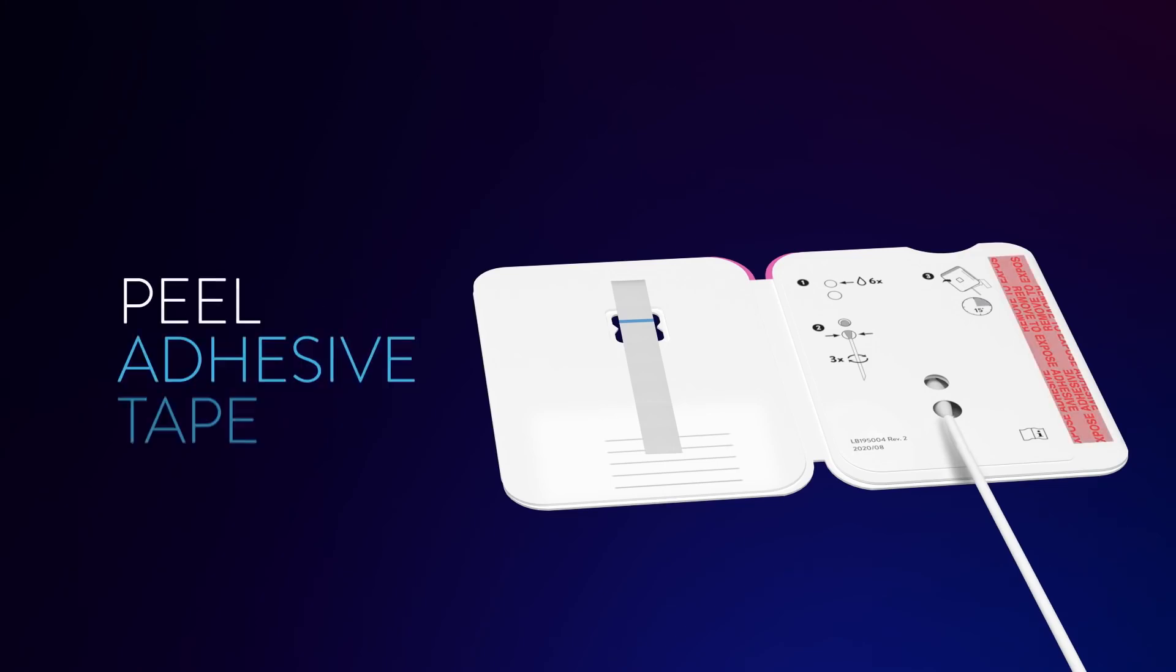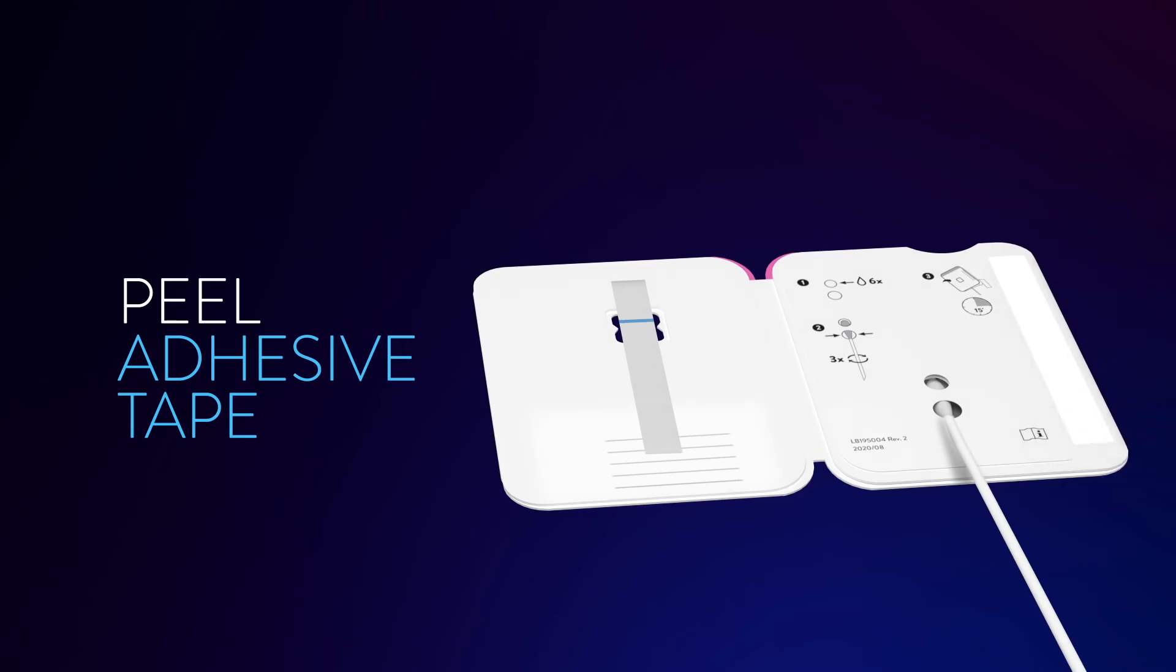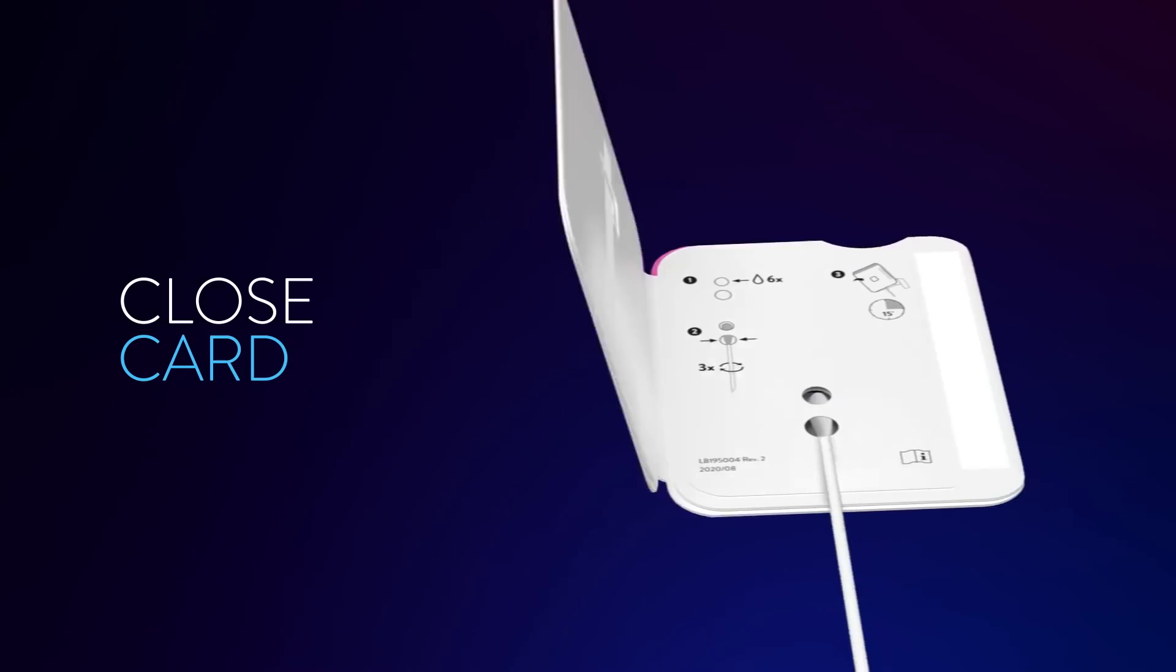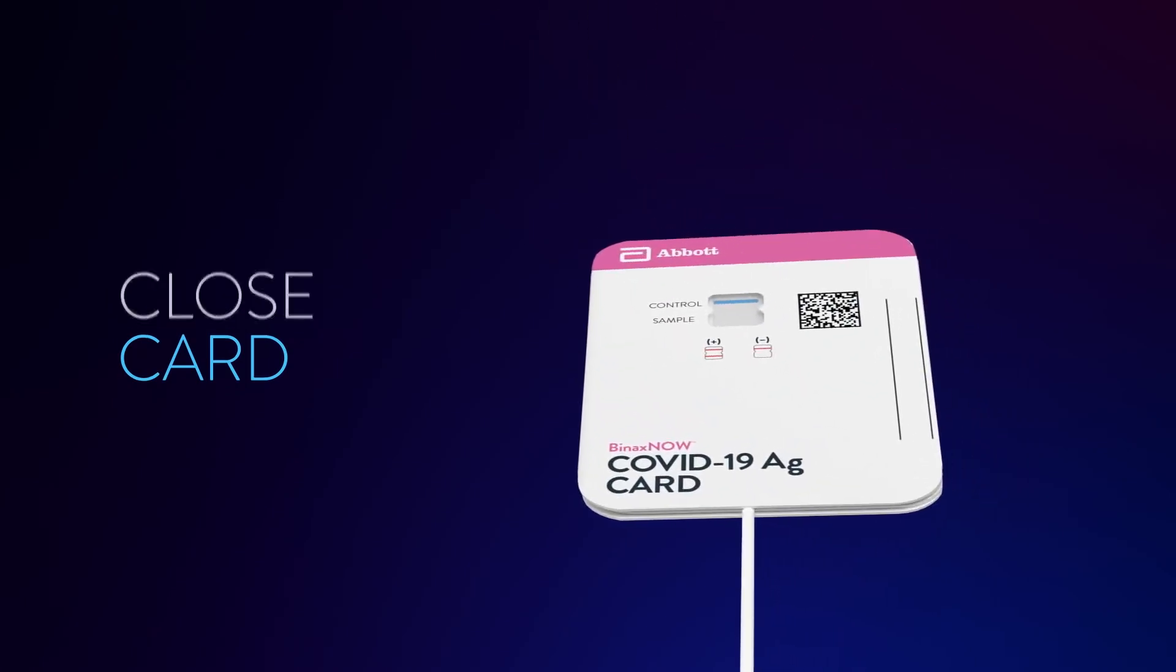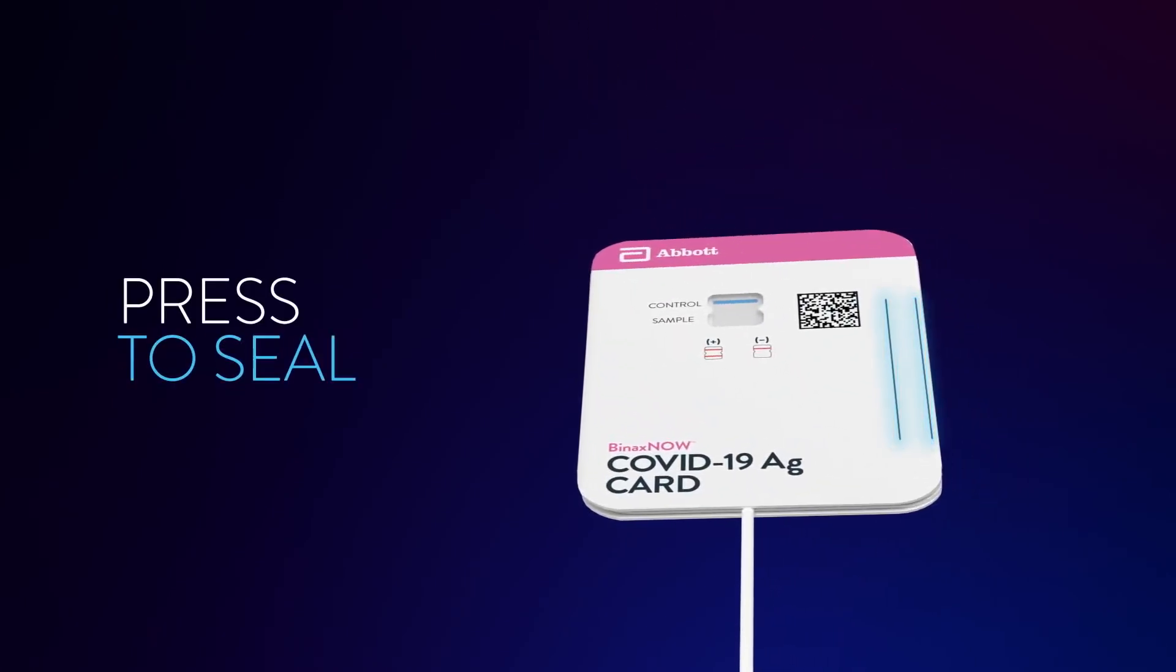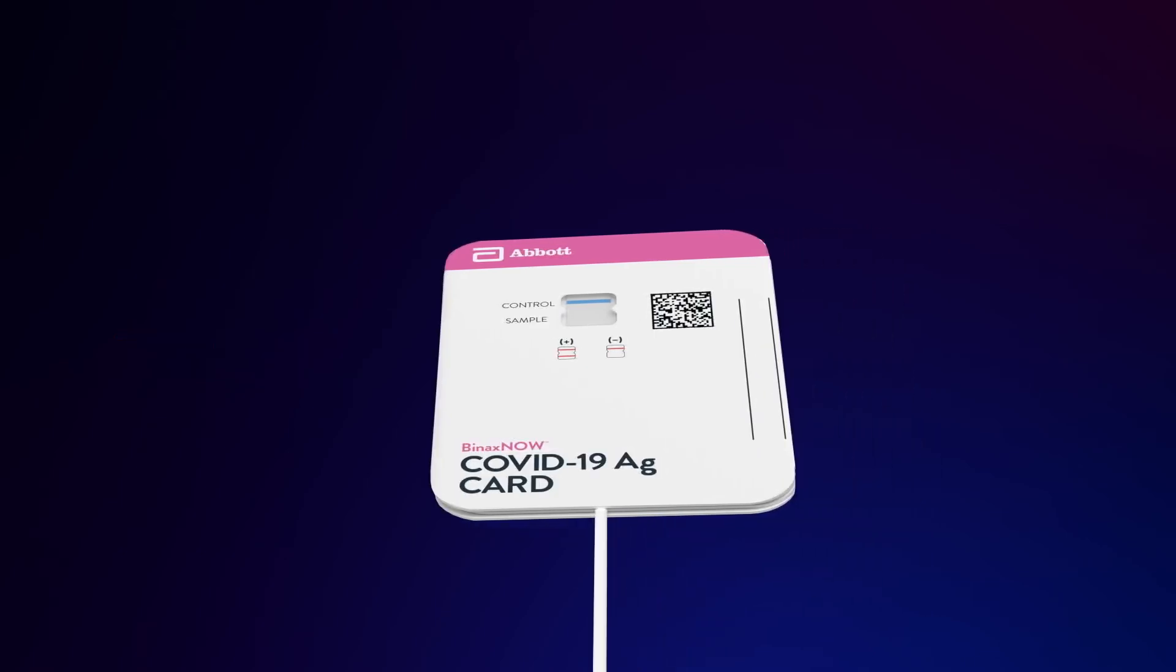Peel the adhesive tape liner off of the right edge of the card. Be careful not to touch other parts of the card. Close the left side of the card over the swab. Press firmly on the two lines on the right edge of the card to seal it. Keep the card face up on your table.